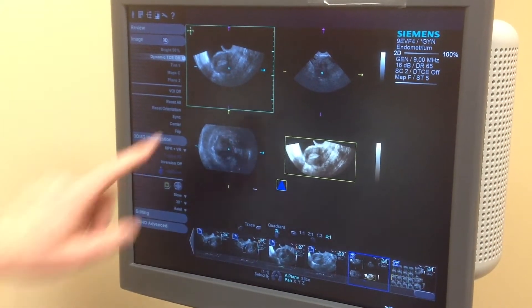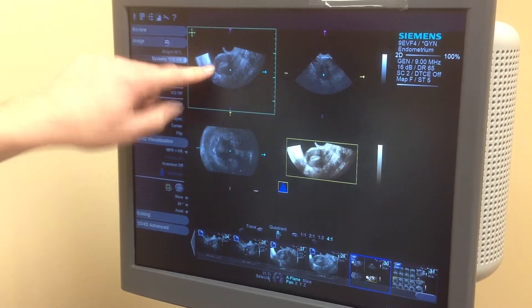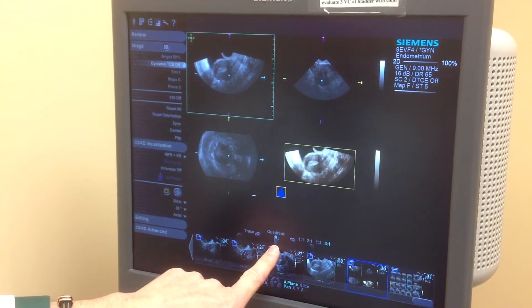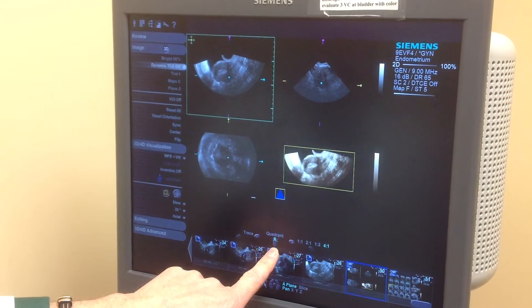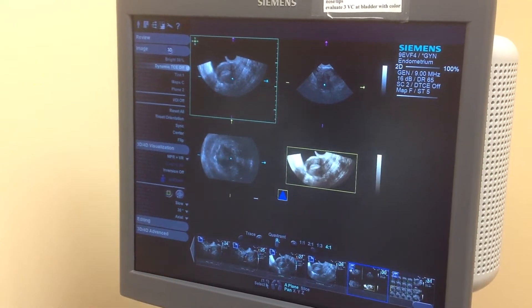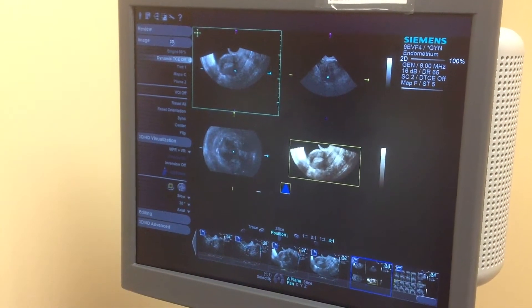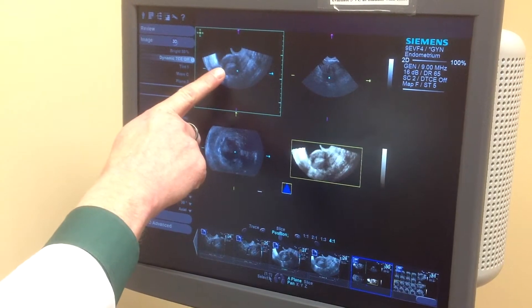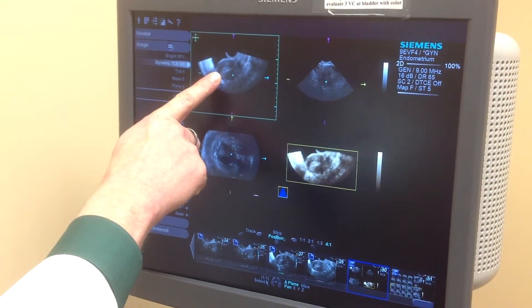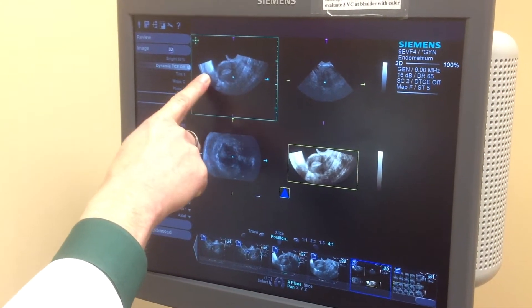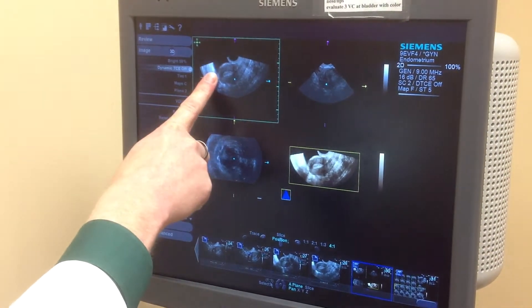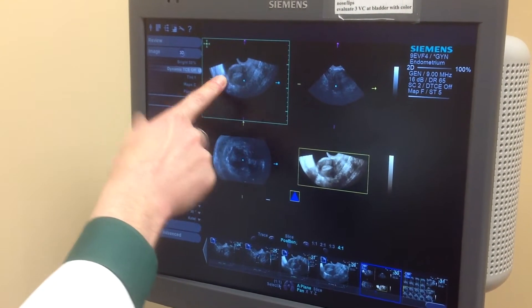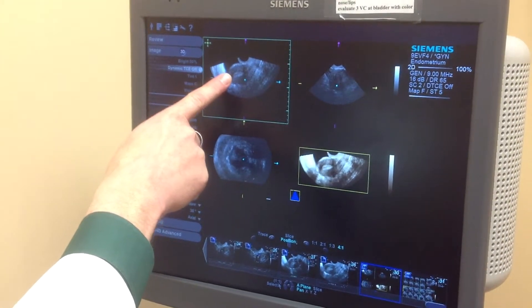If you need to search for the midline picture, you can go through the slices using your thumb wheel. Right now it says quadrant — if I push my thumb wheel in, it changes to slice, and if I dial it, you can see it changing the slices. If you acquire it with a nice midline picture, you shouldn't have to search for the midline slice because it will already be there from your initial acquisition.